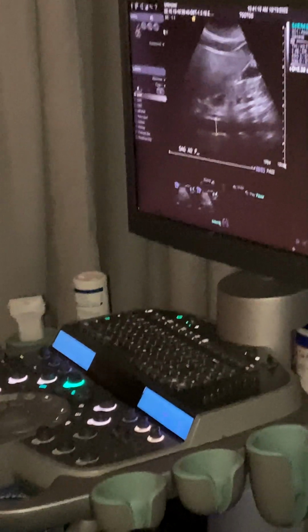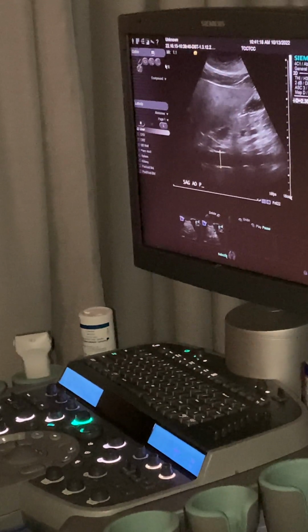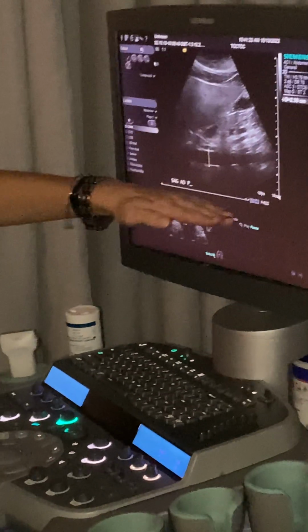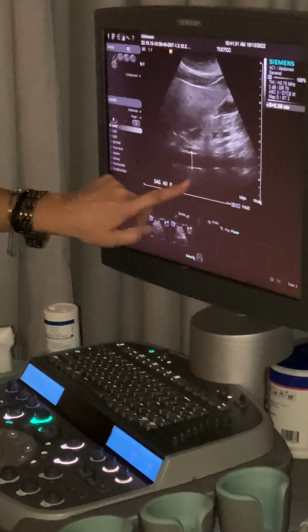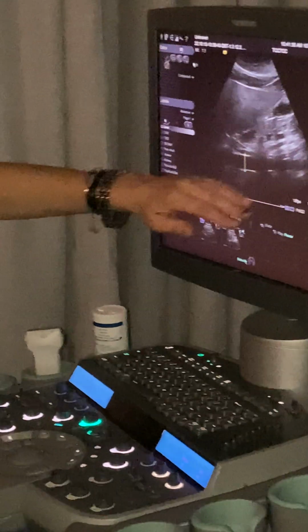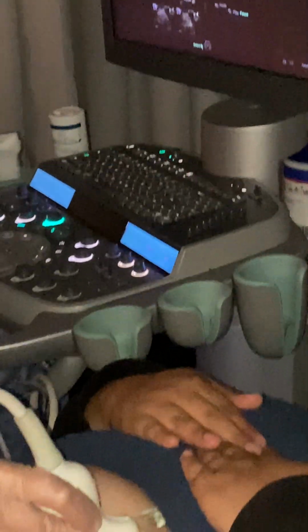And do you need that whole liver? So prox is under the liver, so it's going to live there. I mean, is the aorta not supposed to be towards the middle of the screen? You mean depth-wise? Yeah. So we have enough depth that we're seeing any retroperitoneal lymph nodes, things like that. This is spine down here. We have an appropriate amount of depth because if we got rid of any more, we wouldn't be able to see if there was pathology. Up? You can't get rid of up. You can go deeper or shallower, but you can't get rid of up. There's a thing that we can do called zoom, but we won't worry about that right now. But nope, we're good to go.